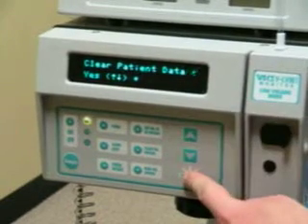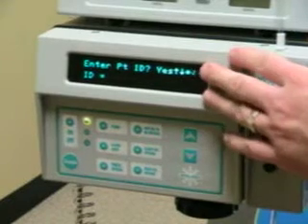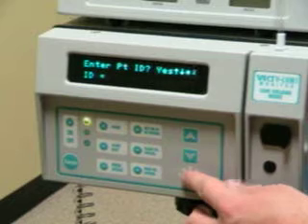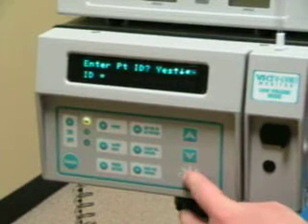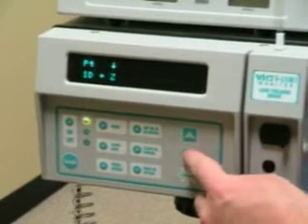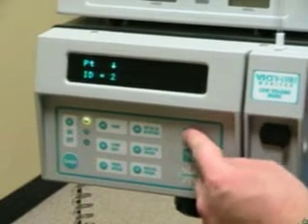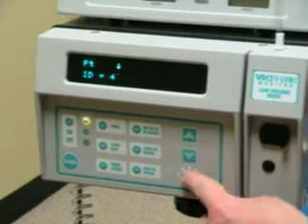Hit the star key. Enter your patient ID. Most of the time this is in medical records numbers, so that's what we're going to do here. We're just going to hit yes, and you want to scroll either up or down for numbers or letters. So we're going to scroll up till we get the numbers we want.